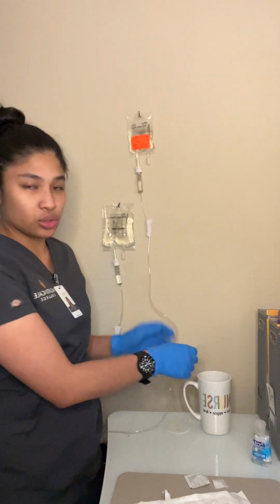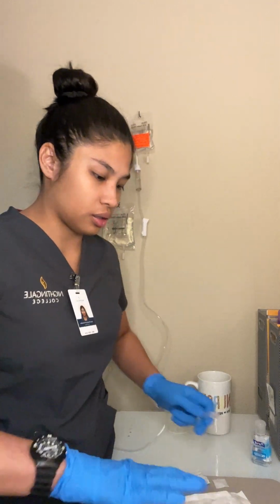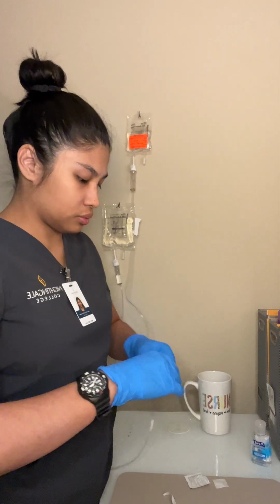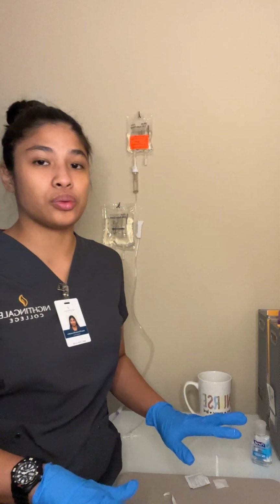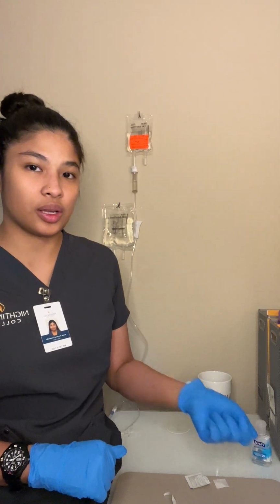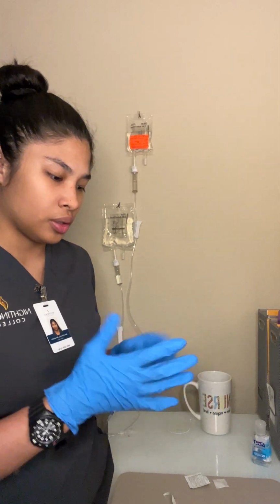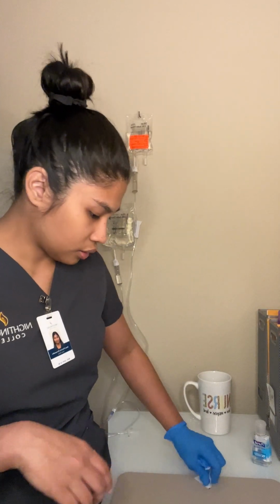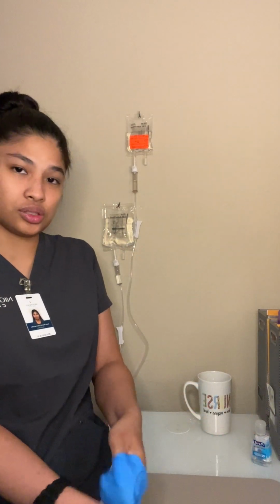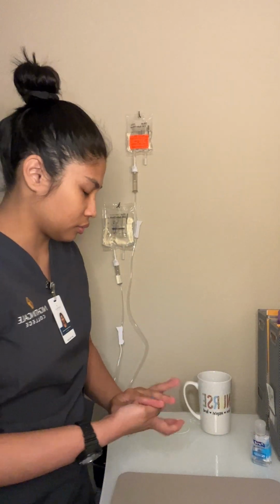Before leaving the patient, you'd want to check that the IV site is appropriate, leaving the bed in the lowest position with the call bell near the patient. You'd want to clean everything off, discard it in the appropriate bin, and then perform hand hygiene. Come back to check in with the patient.